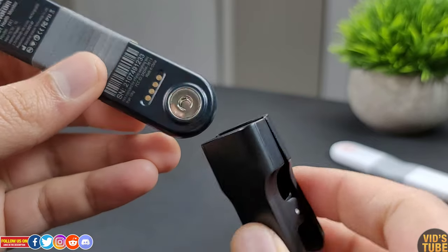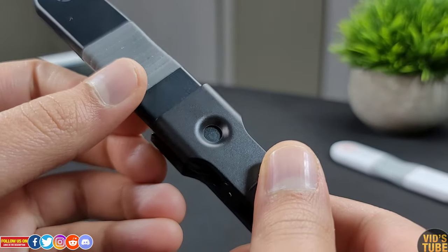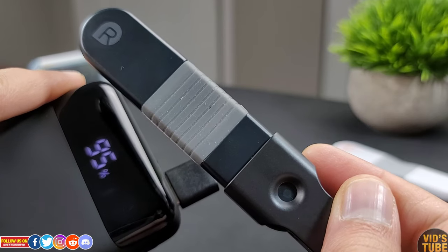The clip part is robust and durable. You can't go wrong with placing the ECG recorder in charging. There is also a cutout on the top to see the LED indicator.